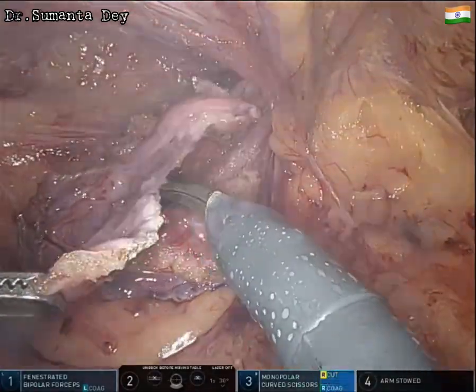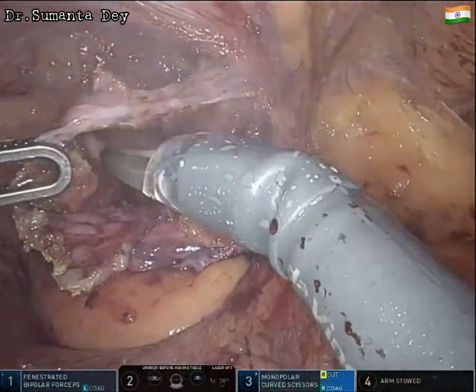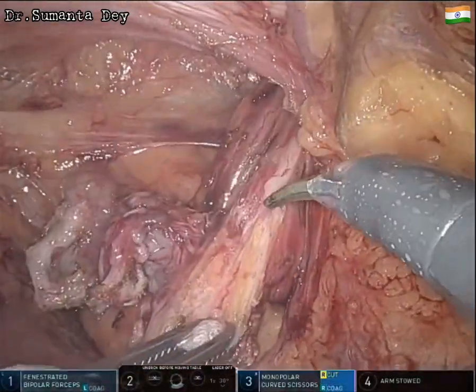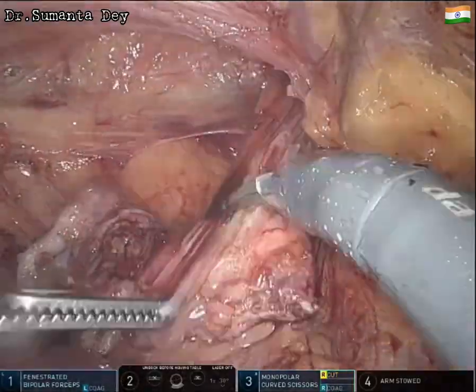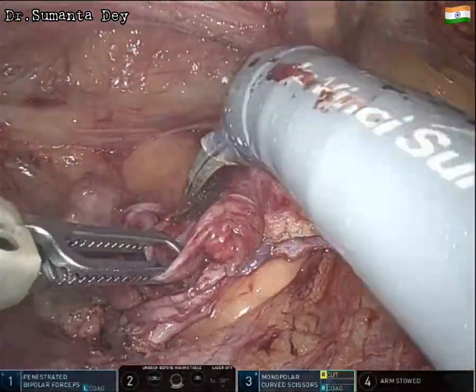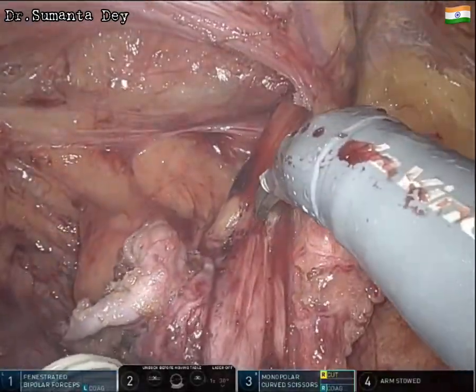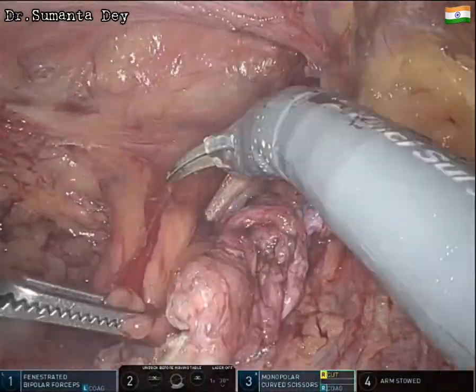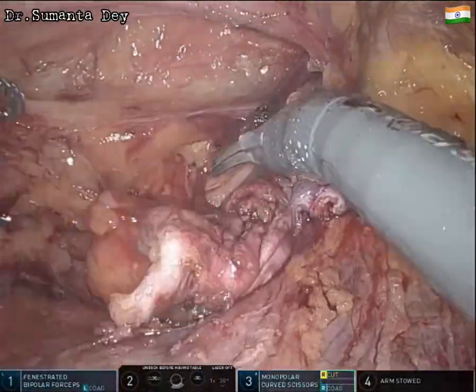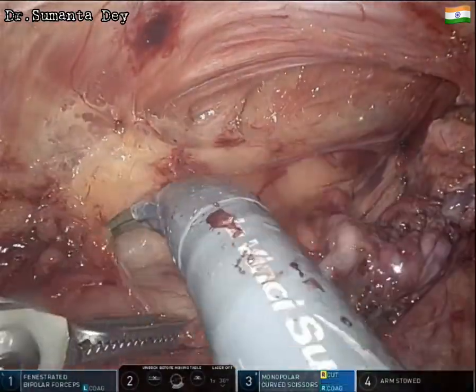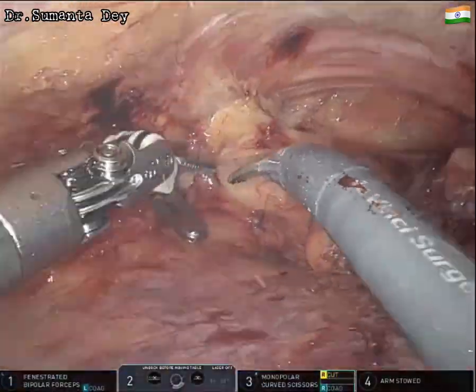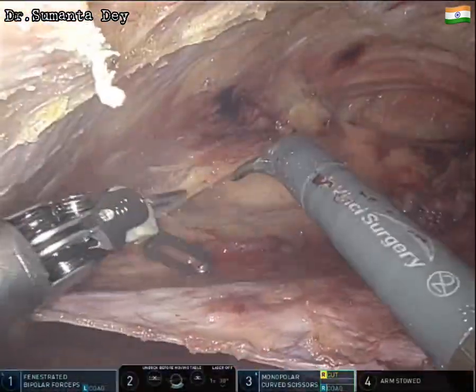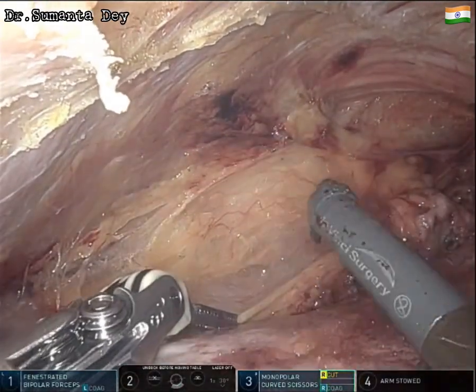Circumferential division of the sac is now complete, leaving behind only the cord structures. Parietalization of the cord structures begins — the vas deferens is visible medially, and the sac is separated from the cord structures so they can lie on the parietal wall. Further lateral space is created in the same plane to establish the space of Bogros.